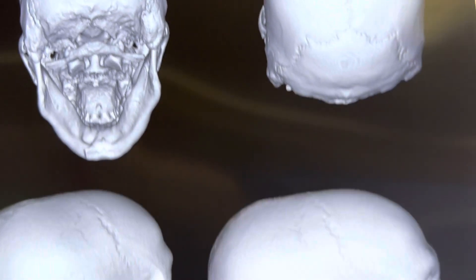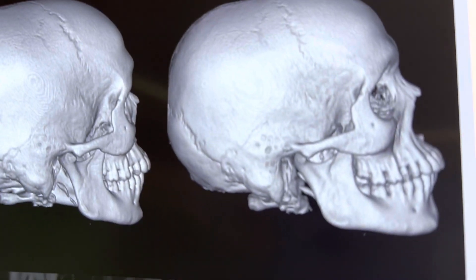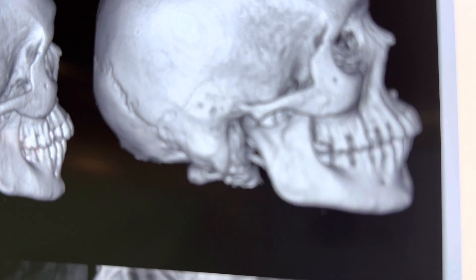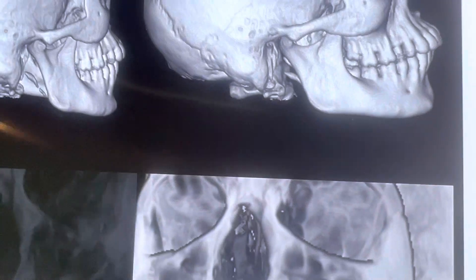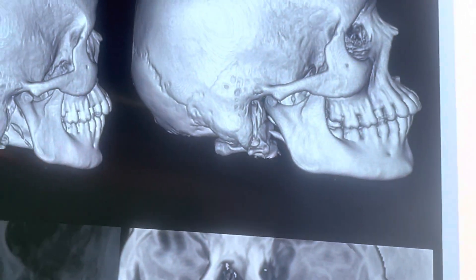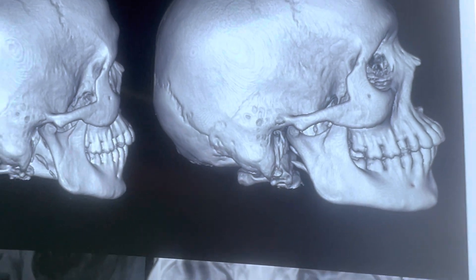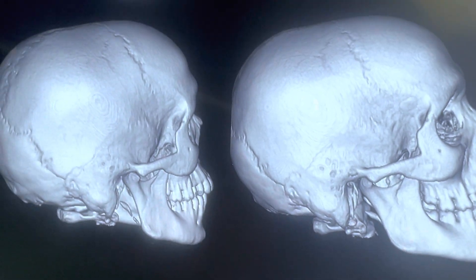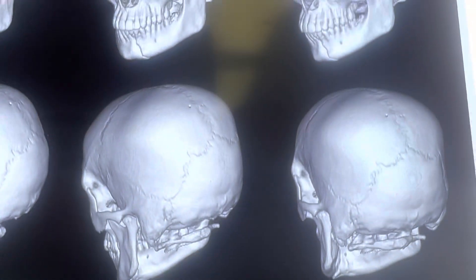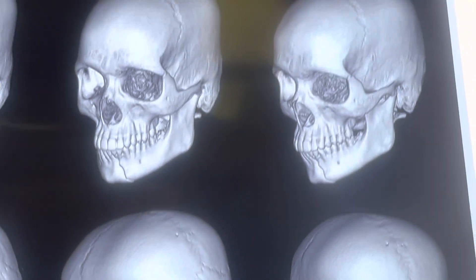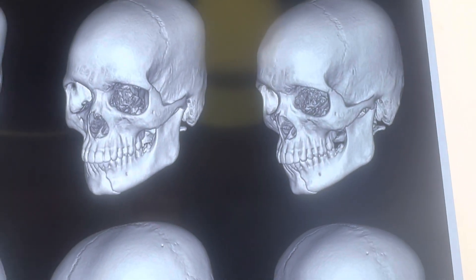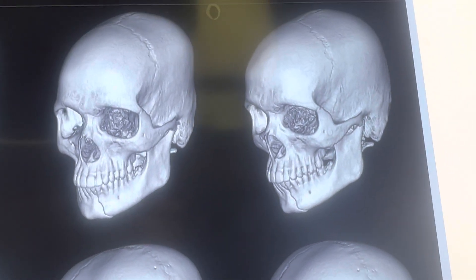There's also a very faint subcondylar fracture here — it's an undisplaced one, just a crack. We're going to let that be. We will be using some arch bars and elastics later on.